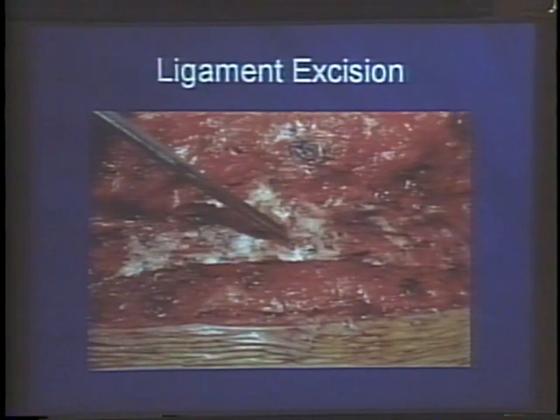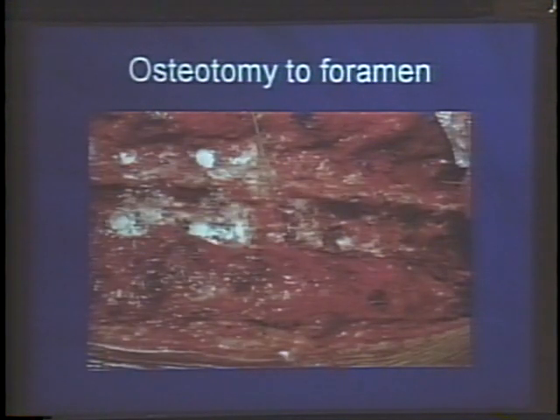The usual width is approximately 6 to 10 millimeters. And I say this can be done quickly. It's easy, and it's quite fast. And this shows the completed osteotomy with the Gelfoam in and the ball probe lying across the osteotomy.